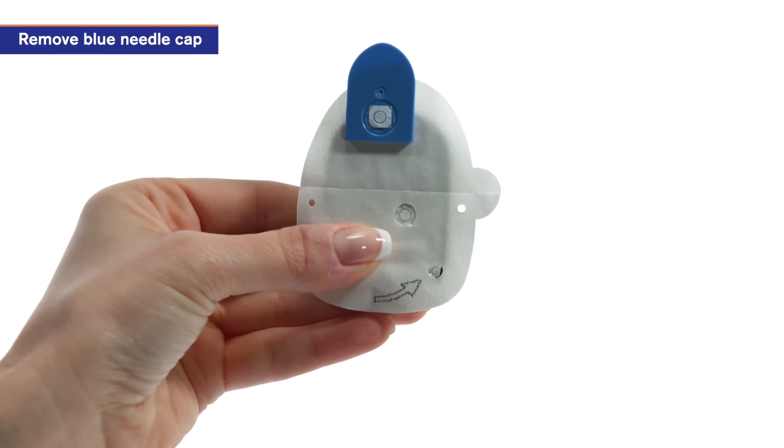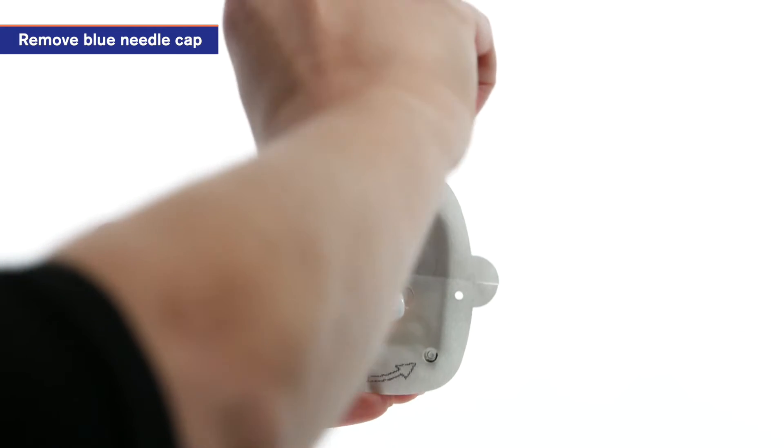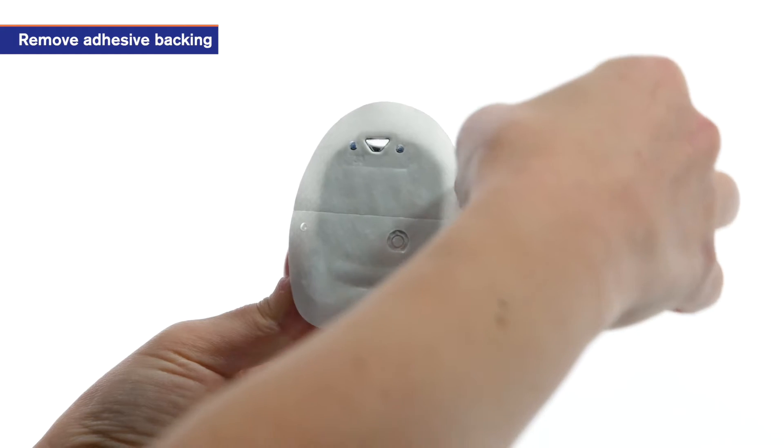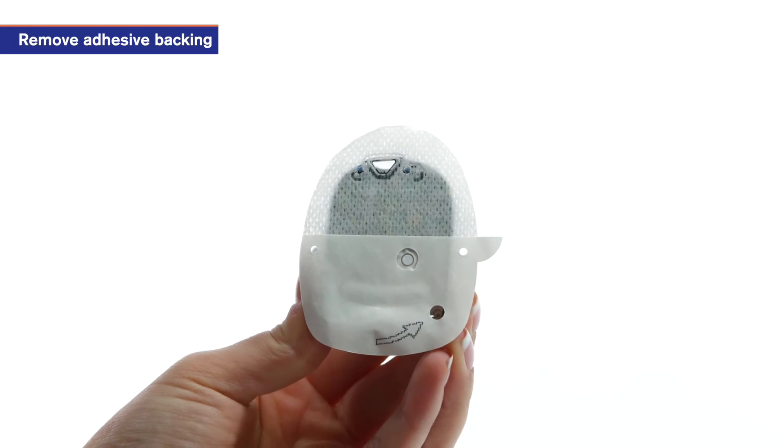To apply a new pod, begin by removing the pod's blue needle cap. Using the pull tabs, remove and discard the white paper backing from the adhesive pad.